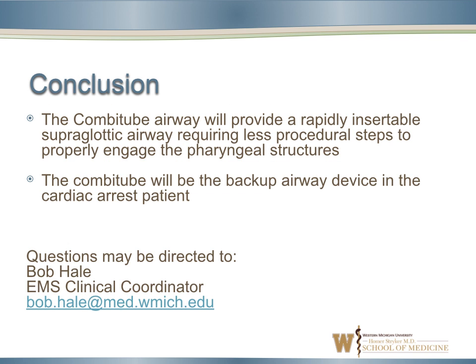So in conclusion, I think the Combitube SA will provide a rapidly insertable supraglottic airway requiring less procedural steps to properly engage the pharyngeal structures. The Combitube should be a backup airway placed in a cardiac arrest patient and is certainly selectable as the primary airway in respiratory arrest patients.